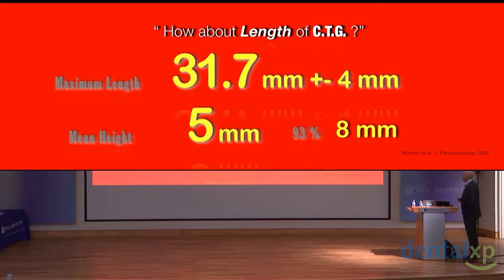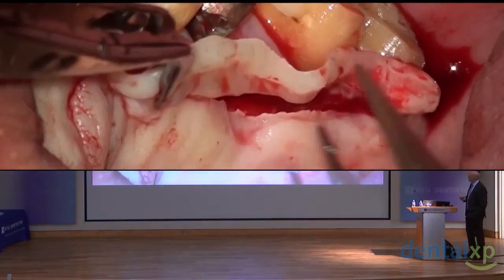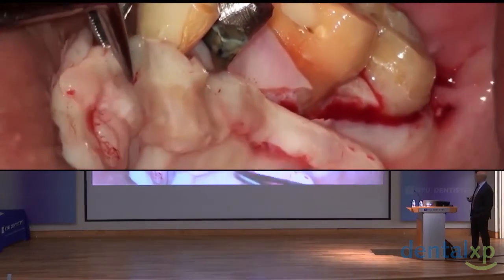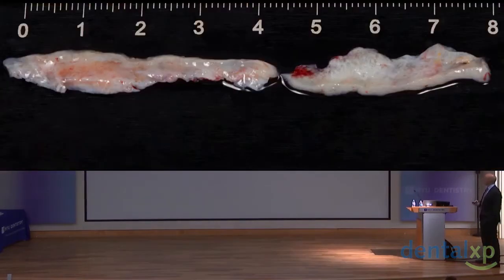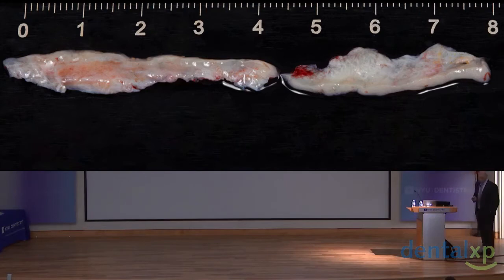How much length am I able to take? Around 35 millimeters and 8 millimeters. This is another video showing you that sometimes I'm able to extend the quantity of connective tissue from the tuberosity to the frontal area. Sometimes I'm able to take around 40 millimeters of soft tissues. And then, if you use both sides of the palate, you end up with 80 millimeters of soft tissues. It's quite a quantity of soft tissues.